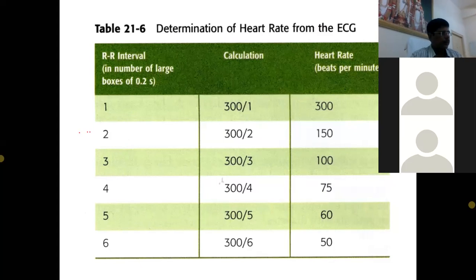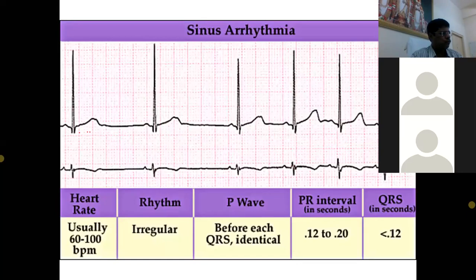Okay. Then you have something called sinus arrhythmia. Anybody can tell me what is sinus arrhythmia? You can just unmute yourself and tell me what is sinus arrhythmia.